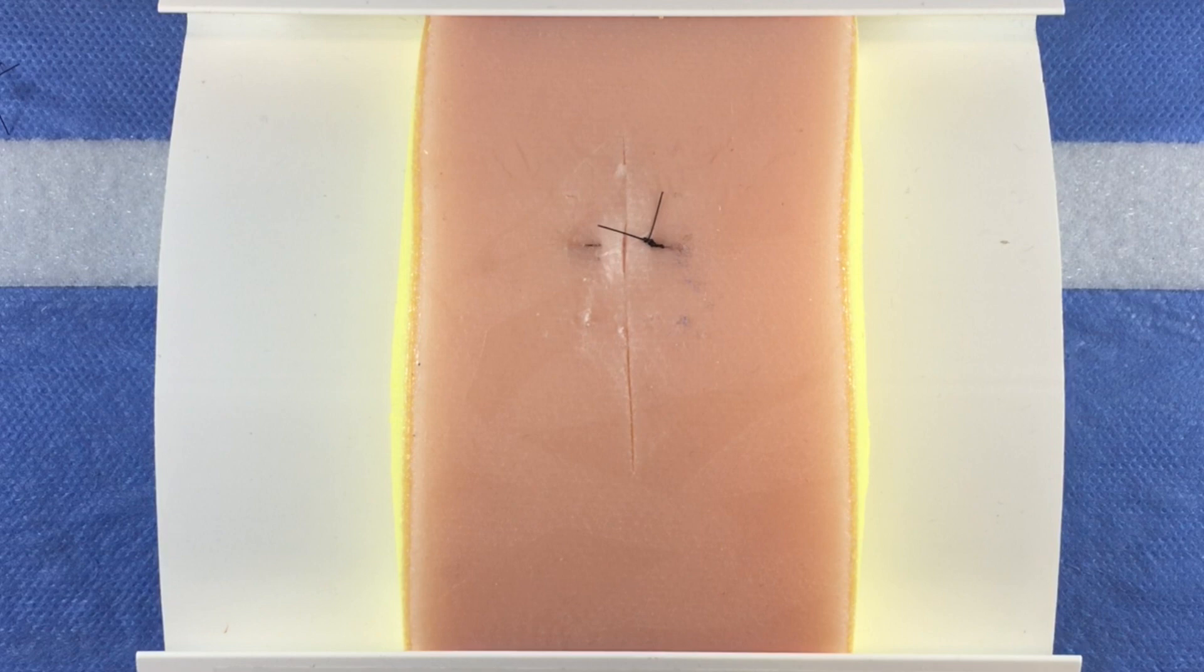A vertical mattress suture is one where there is both a deep and superficial layer placed in a vertical fashion. This is a suture technique that is ideal for deep wounds as it results in a multi-layer closure.